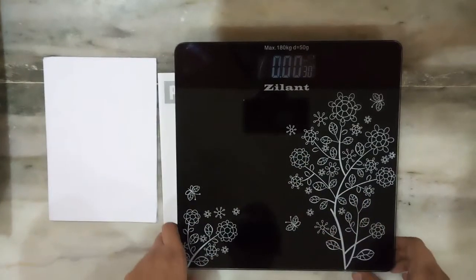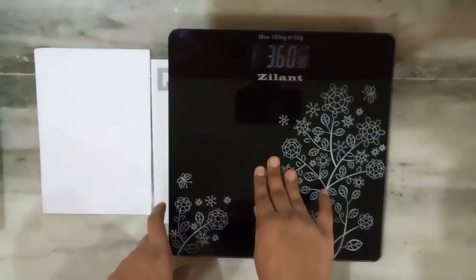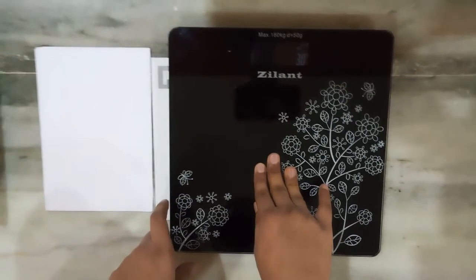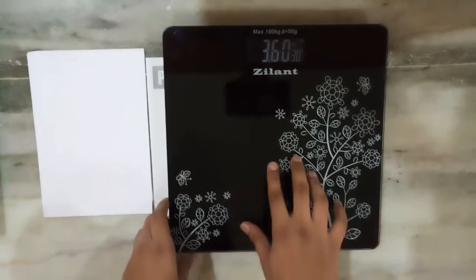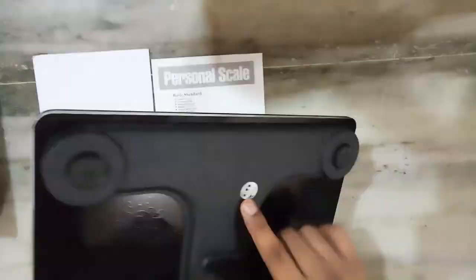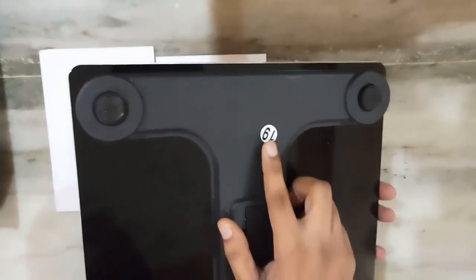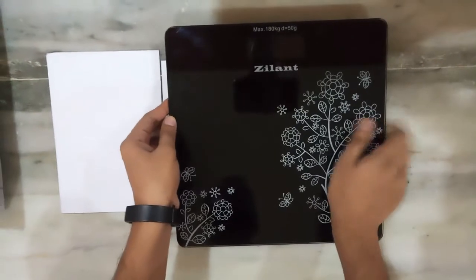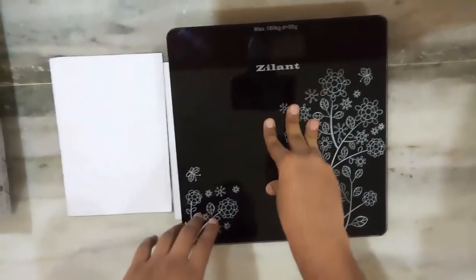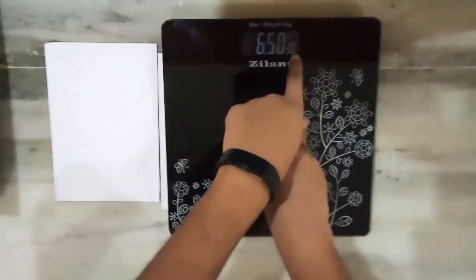So as you can see the scale is working now. If I put pressure on this, it shows the weight. The batteries required are triple A size — two batteries you need. There is a button over here that you can use to change the units. It can be changed into pounds or kilograms.